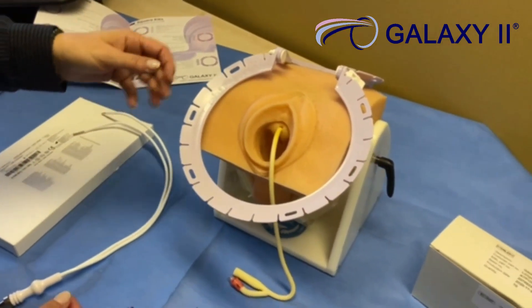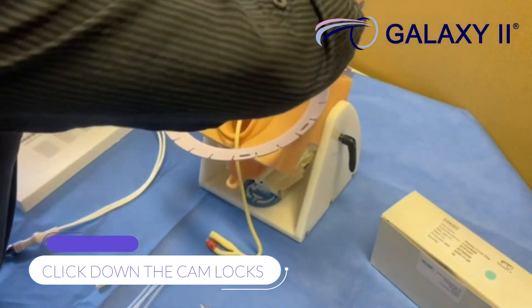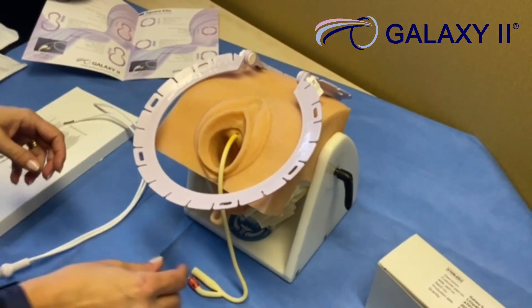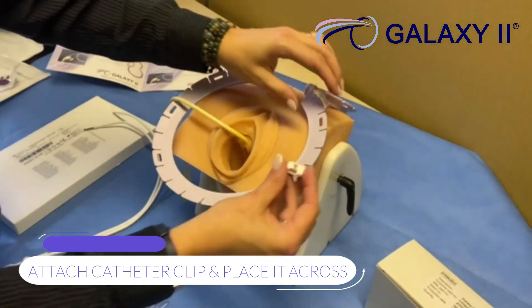When you want to set up the retractor, you place it onto the surgical site and clip down the cam locks to lock it into place. For this procedure, we have a catheter that we need to keep out of the way. To do so, we attach the catheter clip and place it across.